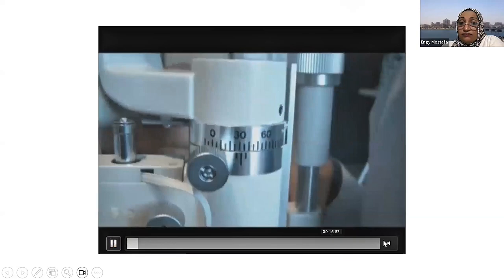This is a very, very common question in exams, especially the oral exams, because so many people miss the point behind it. So you decouple it, and then you start to look. Once you get the halo around the limbus, that's where the light is totally scattered in the cornea. This is how it is.